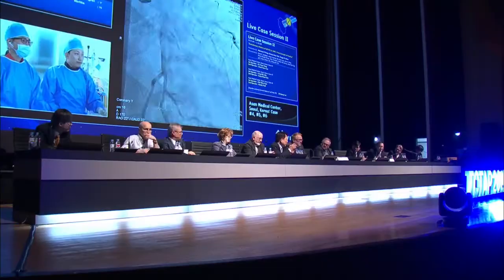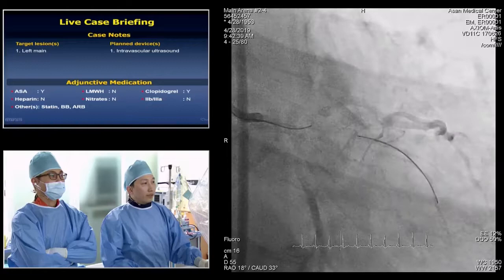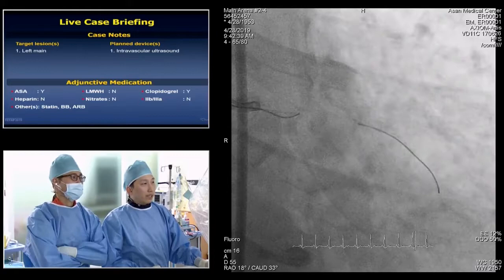Okay, Dr. Kang? Yes. All right. Would you show us the IVUS? Another discussion point: it's a 0.75 positive FFR. You're going to treat them, right? How to treat is the most important. So you're going to show the IVUS first, and we will discuss how to do it later, right? Yes, I wired the LAD and then check the IVUS next.